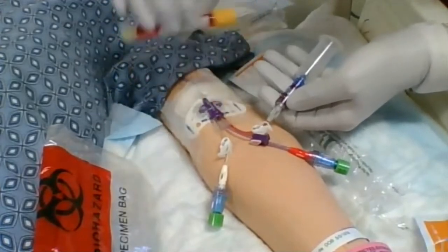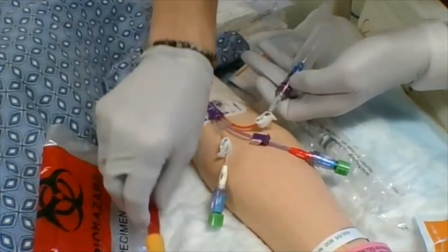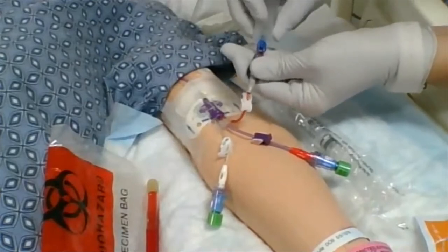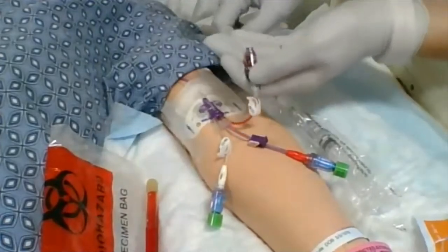I just want to invert it gently a couple of times. Put it right by my biohazard bag. This is clamped — I'm going to take this off. Remember, it does have a sharps component, so we'll make sure that ends up in the sharps container.